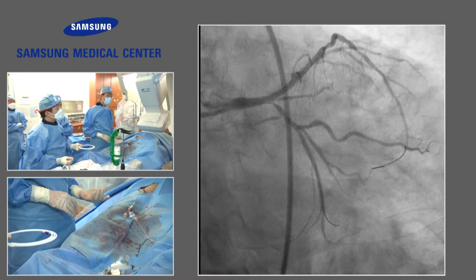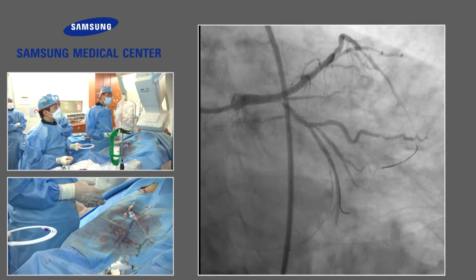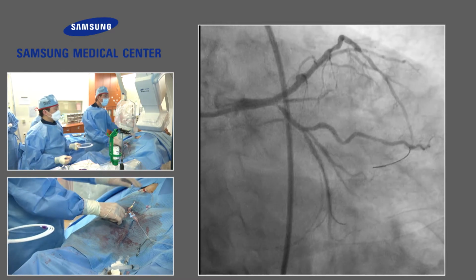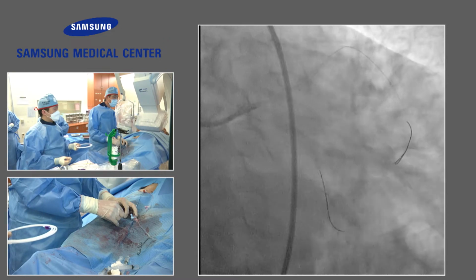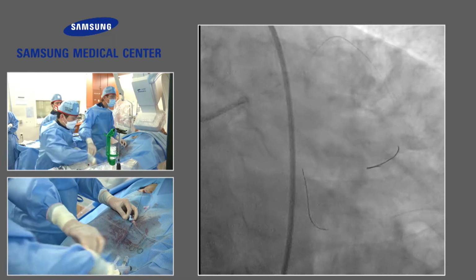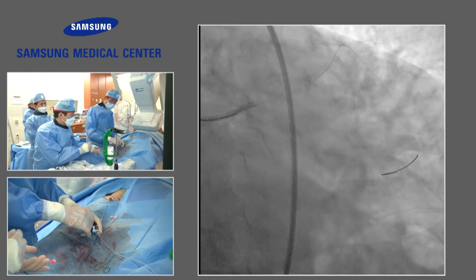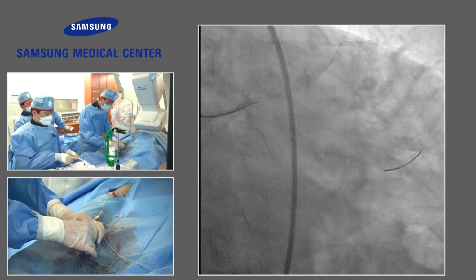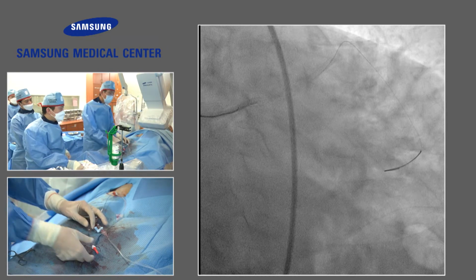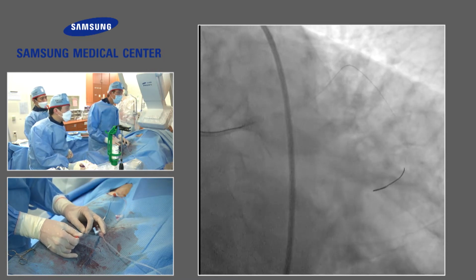Theoretically, many times it works, but Dr. Gwon and I don't like that. There is definitely risk of compromising the circumflex during the left main POT. So I like to rewire. Easily. Anyhow, for the strategy in a very complex and high-risk patient, Dr. Gwon fixed it in a simple and safe way. That's the educational message I like to show to the audience.